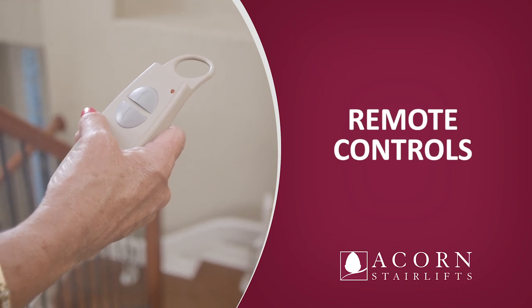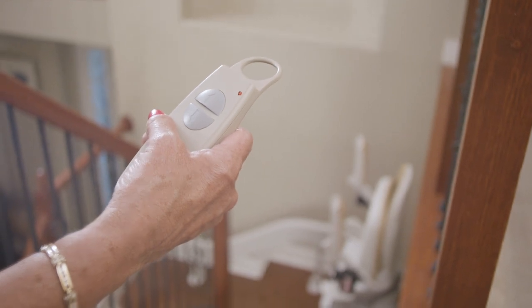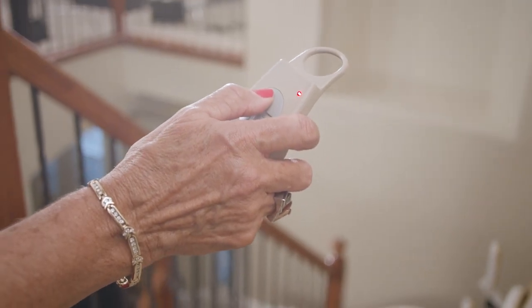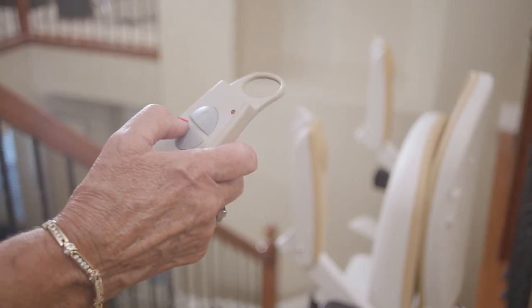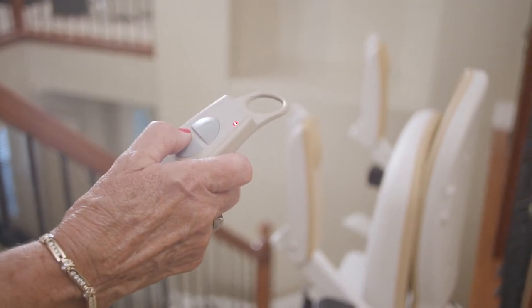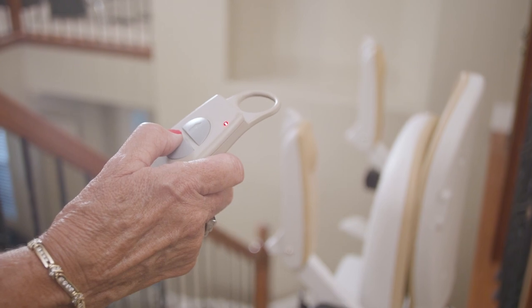Remote controls. The unit may also be operated with the remote control handset. There are two buttons on the handset: up and down. To send the unit up, press and continue to hold the up button. To send it down, press and continue to hold the down button. The unit will automatically stop at the end of the track or if the button is released. For user safety, the paddle control will always override the remote control handset.